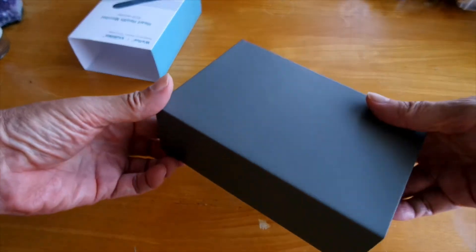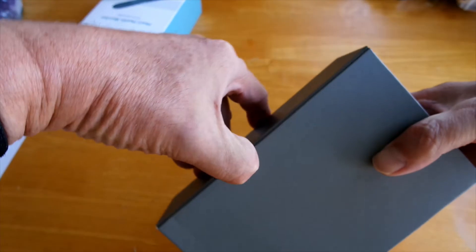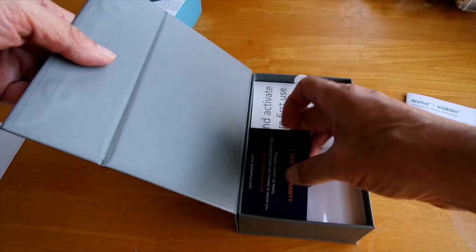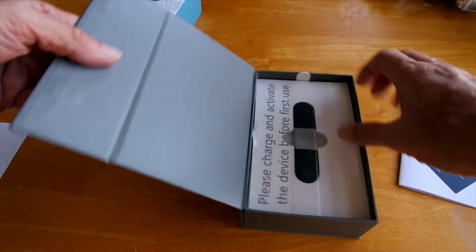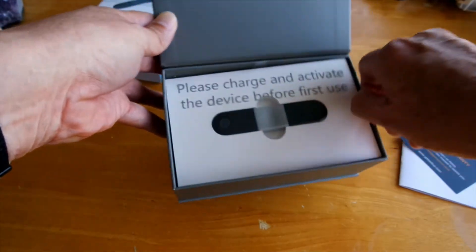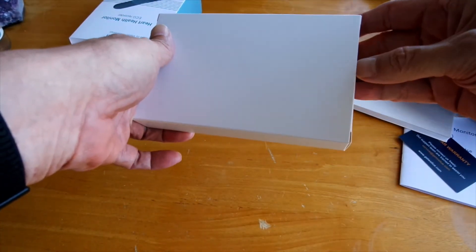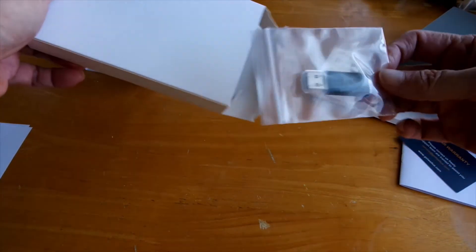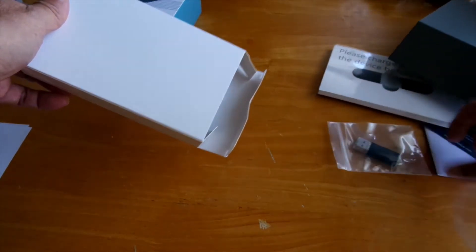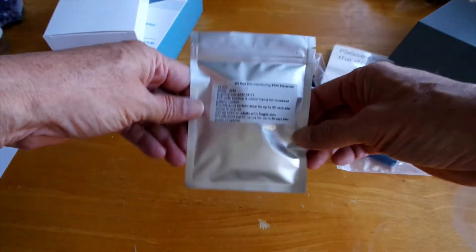The first thing you'll notice is this box, and it's magnetic on one side, so you find the seam, find where it is, pop it open. Inside you get a user's manual, a one-year warranty, the actual device that goes on your chest that needs to be charged, and a little box that has a USB with the analytic software and a chest strap.